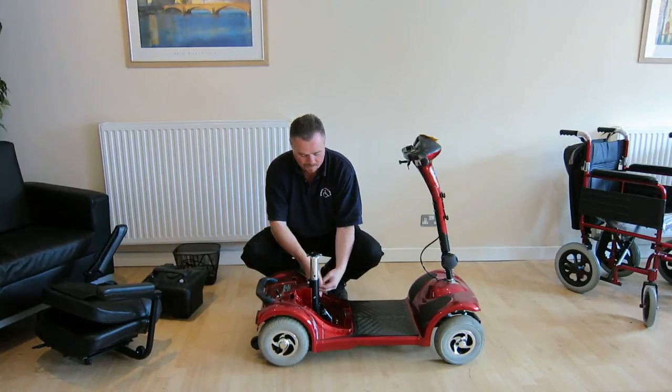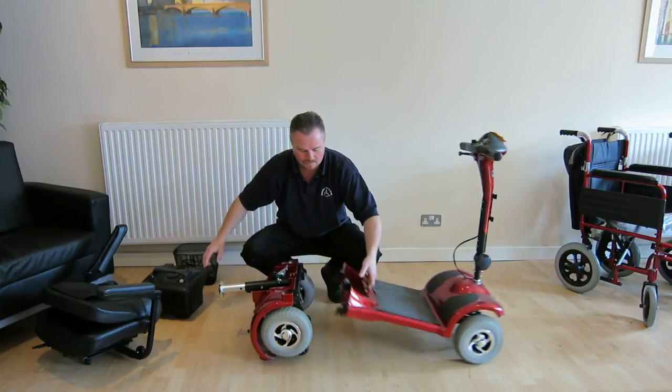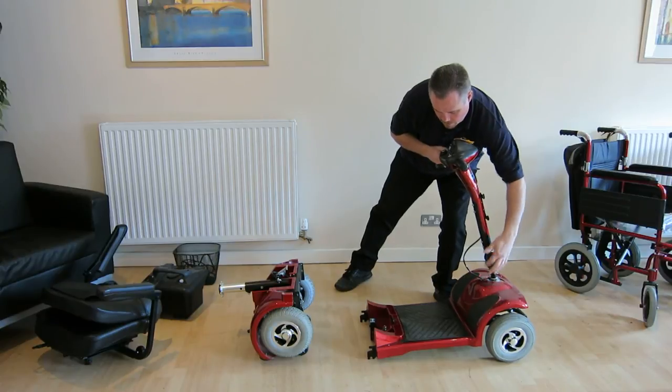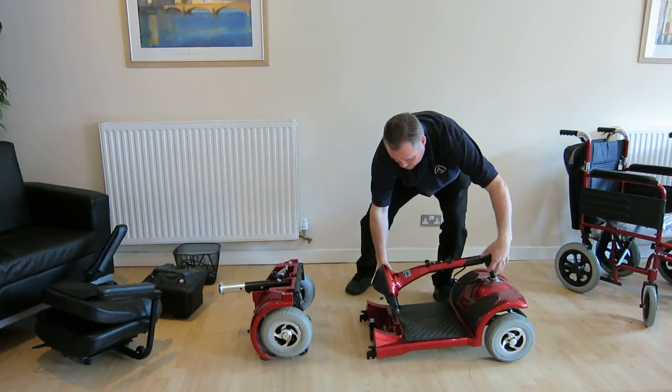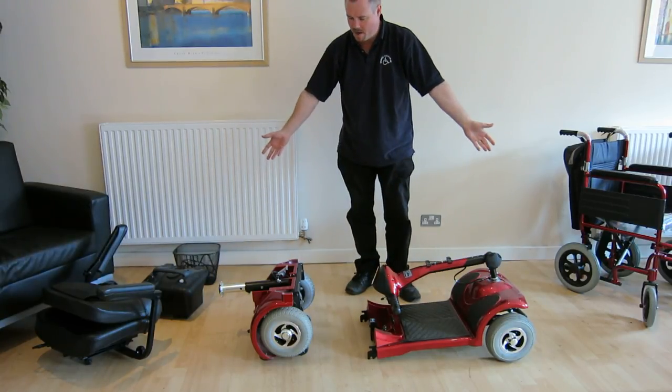Pull out the connector, lift up this little lever. There you are — four main parts. The tiller itself also lowers and you lock it off. And that's how it loads in the boot of the car, four pieces.